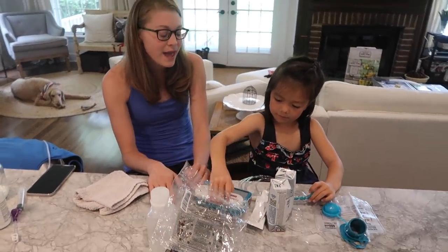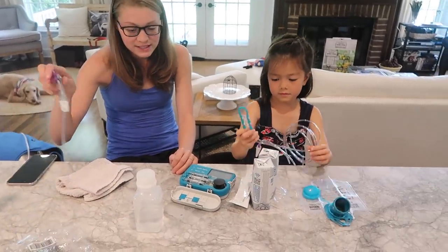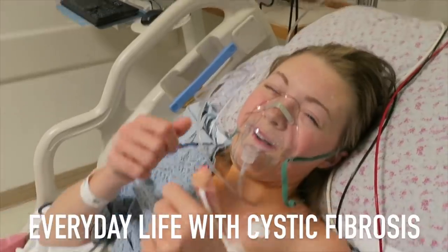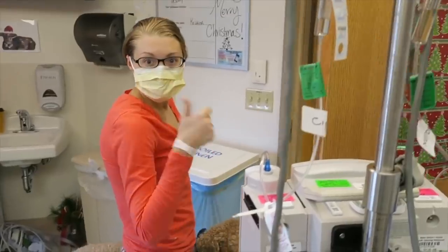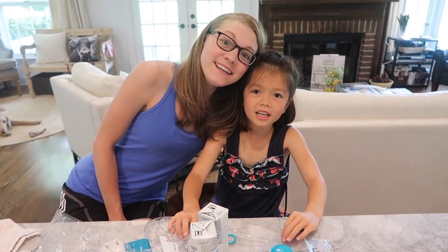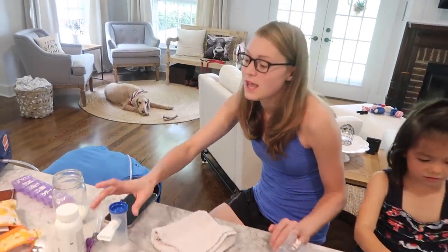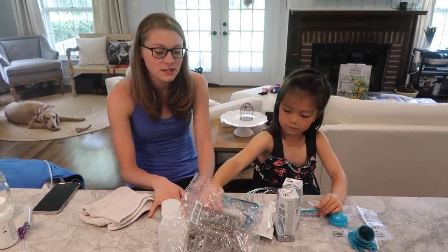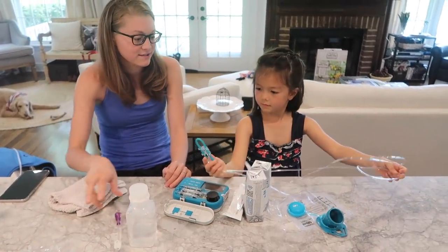Good morning from Kentucky! Just finished my vest and my meds. Now we are actually going to set up my feeding tube, and Emma has been into helping me with this, so she's gonna set it up this morning.